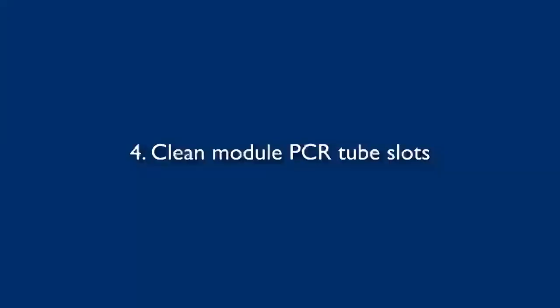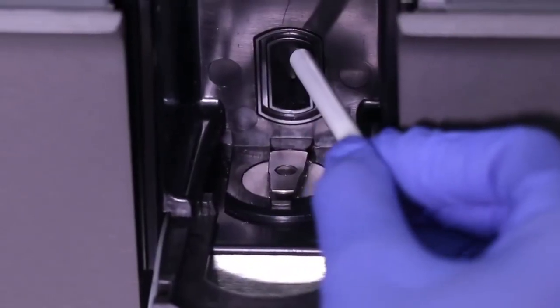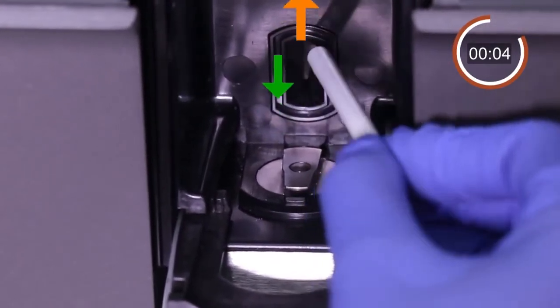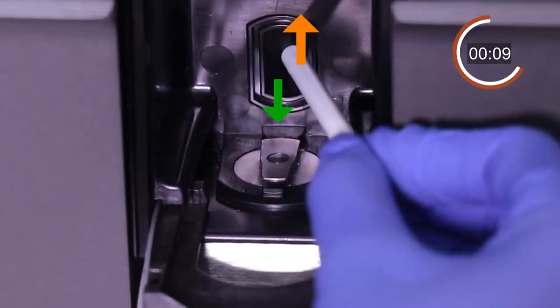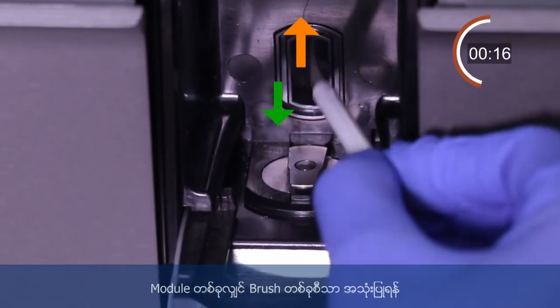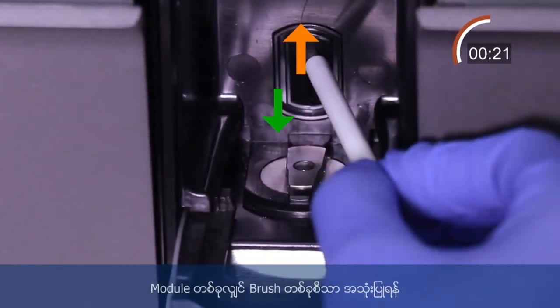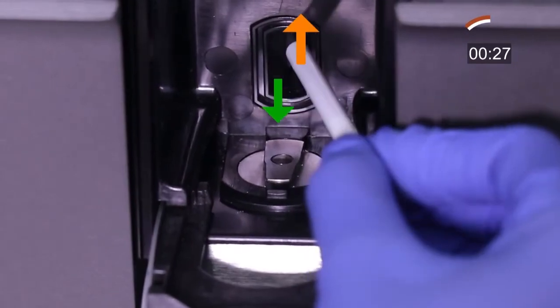Next, we will continue to demonstrate how to clean the module PCR tube slots. To clean the PCR tube slot, insert the brush bristles completely into the PCR slot, then brush inside with several up and down movements, twisting the brush between thumb and forefinger. Clean every module for at least 30 seconds. After cleaning all modules, brushes are washed with 70% ethanol and kept dry for next use. It is important to use one dry brush for each module PCR tube slot.